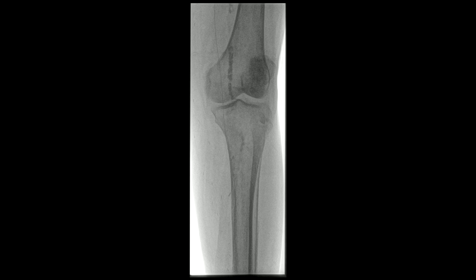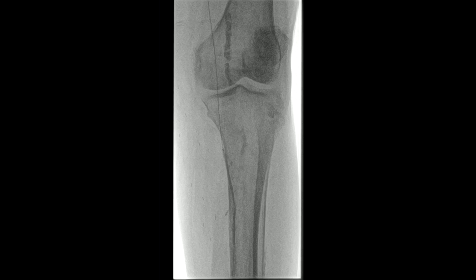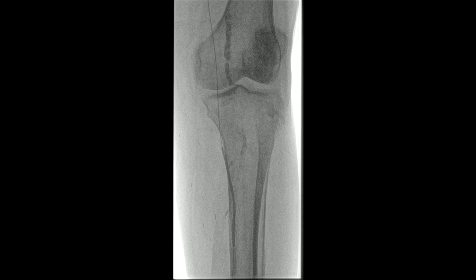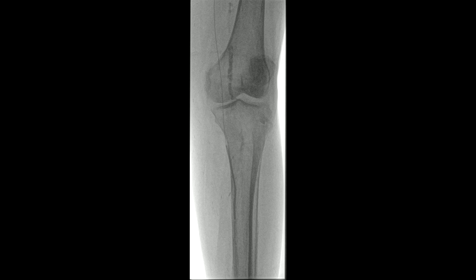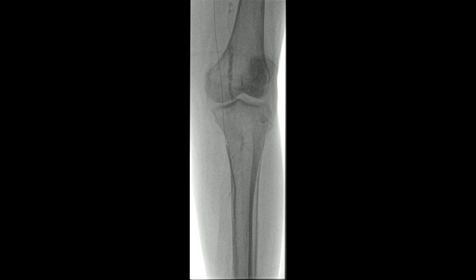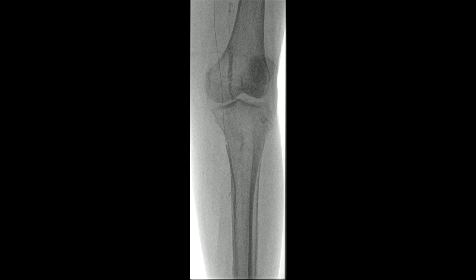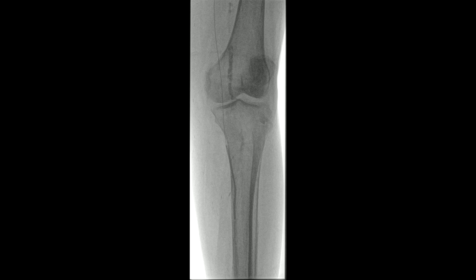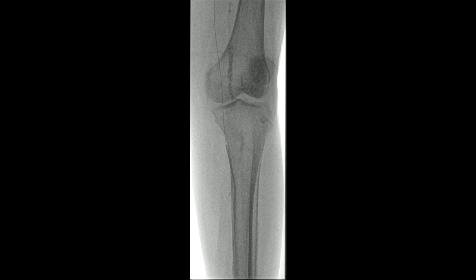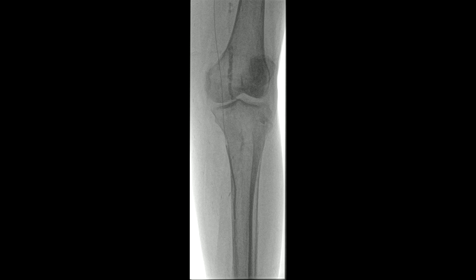The problem now is the distal anastomosis. Either the same balloon or a slightly smaller balloon is used, because it needs to go down into the posterior tibial artery, which limits how big a balloon you can use. We're using a longer balloon. You always want to fully deflate these balloons and confirm they're fully deflated before pulling them back, particularly if there's a stent. The balloon's up — we'll take it down and inject dye to assess the result. When you leave it inflated for a longer period, it's because you're using a drug-eluting balloon.